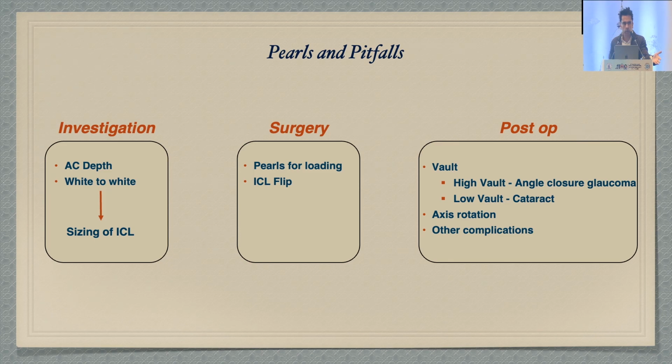So the pearls and pitfalls which I want to get into in complications of phakic ICLs are: during investigation, what are the complications; during surgery, what you can face; and post-operatively, what you can face, and how do you deal with it.